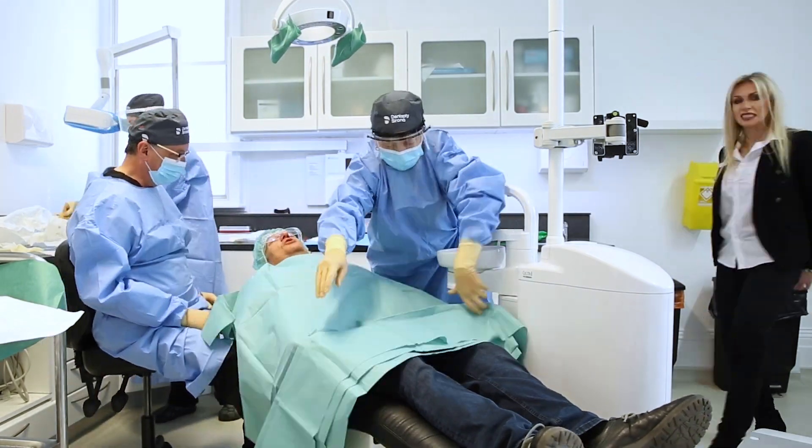The Omnitaper really is a versatile implant to use in all situations. I find it very intuitive to use — the whole surgical system is nice and straightforward. It's an extremely reliable implant, so it's got everything I'm looking for in an implant.